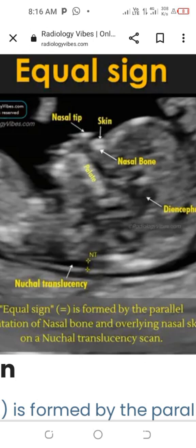What is the nuchal translucency? Nuchal translucency is the normal fluid-filled subcutaneous space identified at the back of the fetal neck, usually measured between 11 weeks 3 days to 13 weeks 6 days of the gestation. Increased nuchal translucency is related to dilated lymphatic channels.